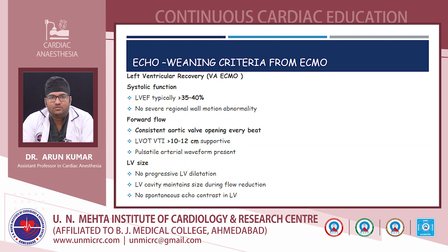TEE also provides an important aid in weaning from ECMO. It is important in assessing the patients who are candidates for weaning. Ideally the LV systolic function should improve, to around 35 to 40%. There should not be any severe regional wall motion abnormality, and aortic valve opening should be consistent in every beat.